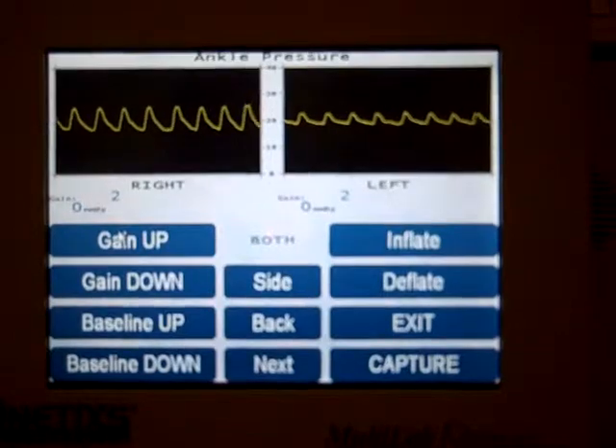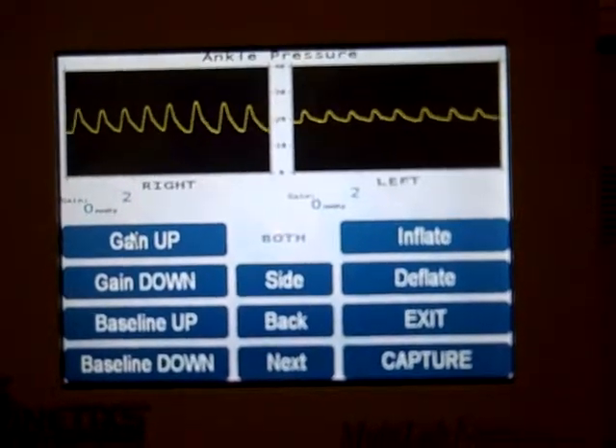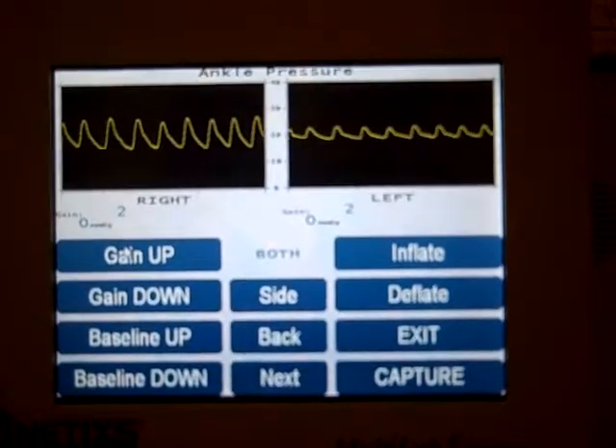In this video, I'm going to demonstrate taking ankle pressures on the Multilab 2CP using the PPG sensors on the toes.